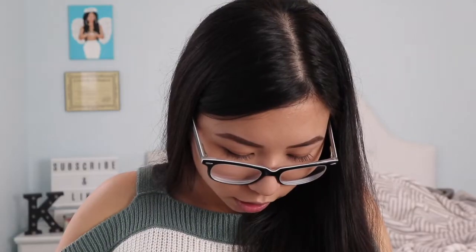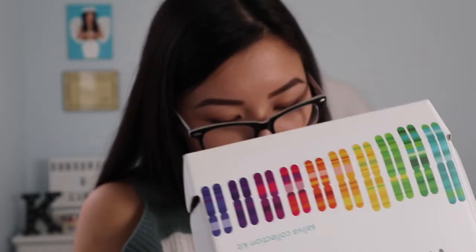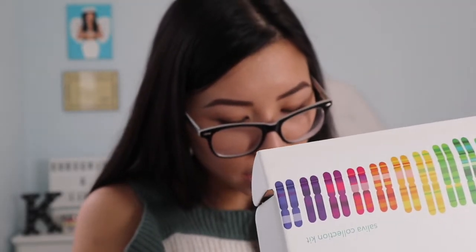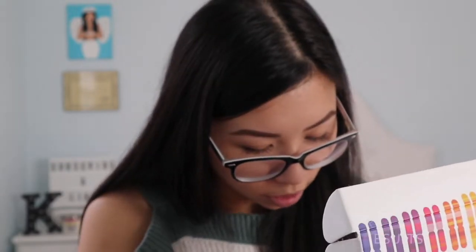What this is is a saliva test — you just spit into this tube and you send it off to the labs where they find out your ancestry and then send it to you through email or something like that. This is the box that you're gonna send off; it already has everything on it to send back. So we're gonna spit to the fill line, close the funnel, detach funnel, screw on cap, seal in bag, and then mail the kit. I'm nervous I'm gonna mess this up somehow.